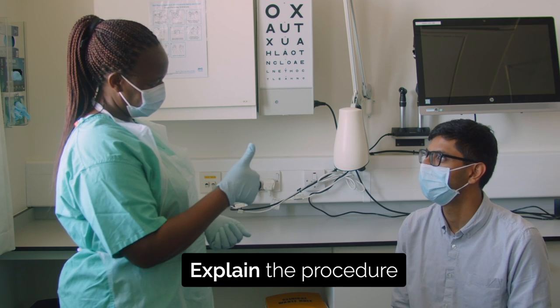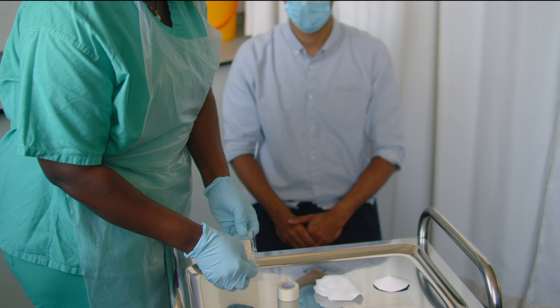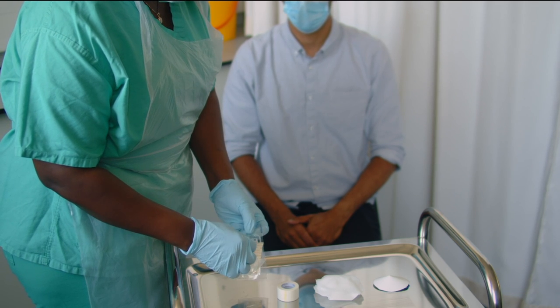Explain what you're going to do and gain consent. Remind the patient to do their best not to open the eye under the pad and shield.